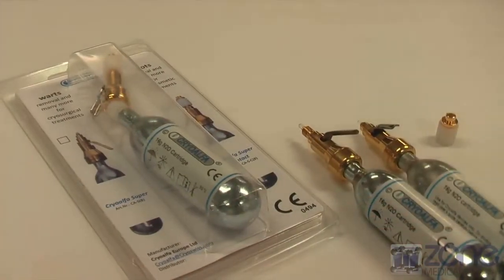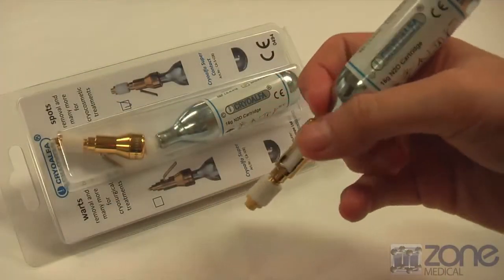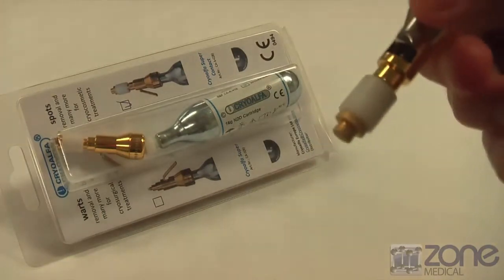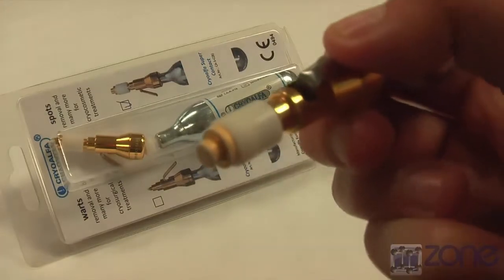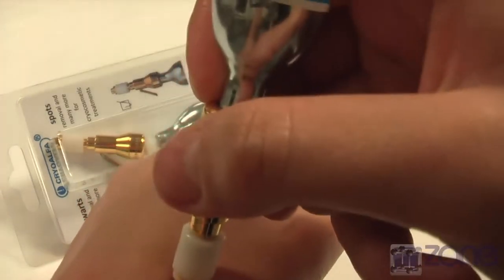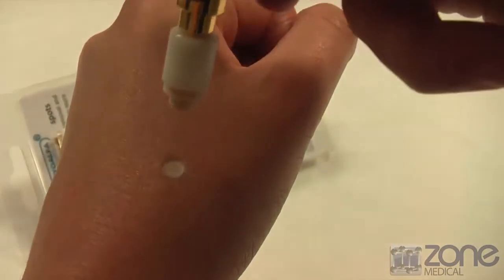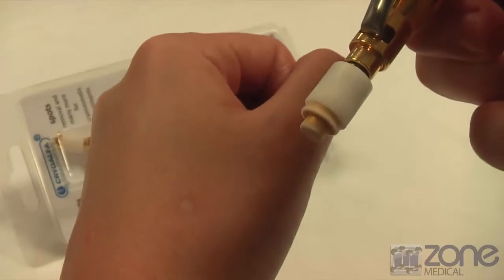To use this device it needs to be in direct contact with the skin. You will need to hold the cartridge in an upright position to allow liquid gas out of the device. For the contact applicator, you will need to freeze the tip before applying to the skin, so let the gas flow for at least 10 seconds. You will see cold vapour appear on the tip. As it is so precise, there is no destruction of biological function and structures, and it provides excellent cosmetic effects.